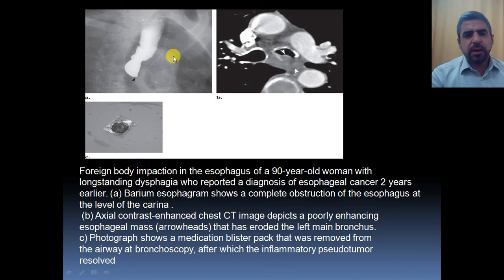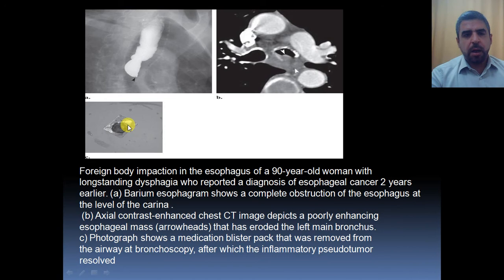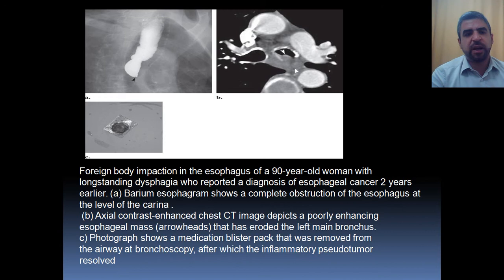This is an elderly woman of 90 years old, previously diagnosed with esophageal carcinoma. Esophagography shows complete obstruction of the esophagus near the level of the carina with no passage of contrast distally. On CT scan, there appears to be a mass-like lesion corresponding with the esophageal carcinoma diagnosis, appearing to invade the posterior wall of the left main bronchus. However, upon endoscopy, there was a blister pack — a pill cover — chronically impacted in the esophagus, resulting in inflammation and a mass-like lesion very similar to esophageal carcinoma. There was no esophageal carcinoma — just an inflammatory pseudotumor, which completely resolved after removal of the impacted foreign body.